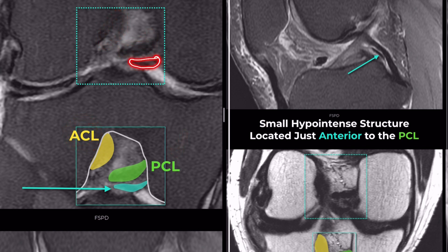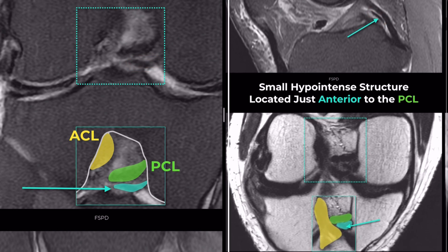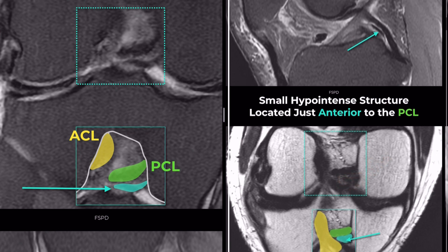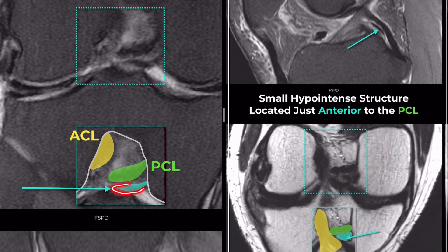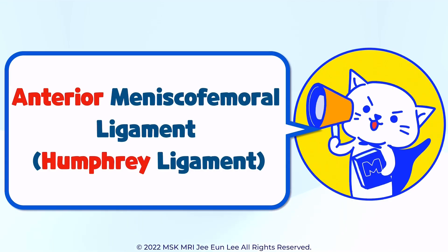What is the aqua color structure we see here? This structure has a distal attachment compared to the PCL and runs just anterior to the PCL on the sagittal image. It can also be seen on the oblique coronal image. Is it a PCL tear or a meniscal fragment? This is the anterior meniscofemoral ligament, also known as the ligament of Humphrey.